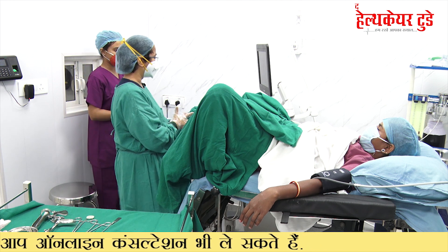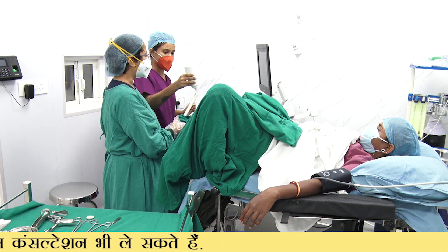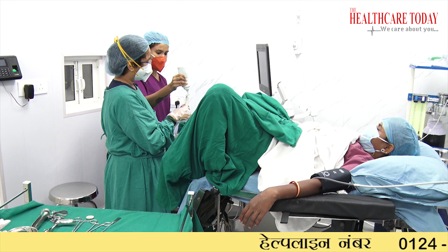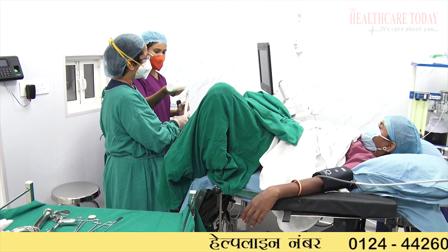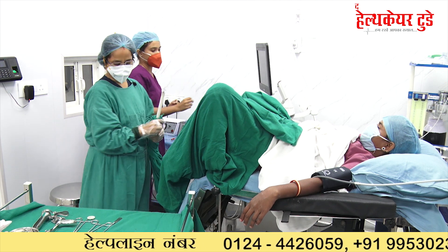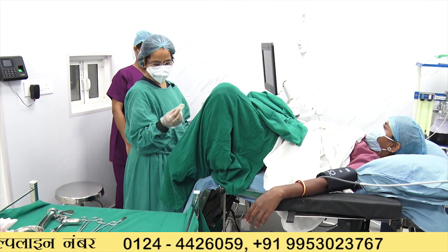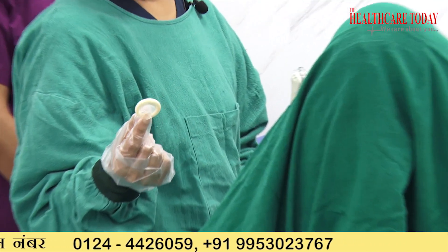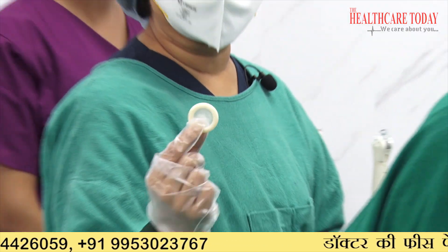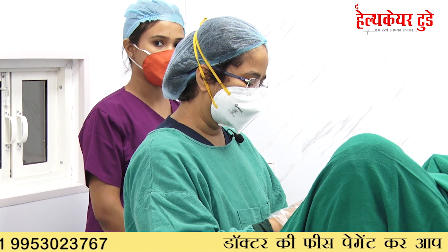Now the jelly has to be applied on the probe. You have to ensure you are not touching the jelly with the same hands. It is very essential that you apply the jelly on the inside of the probe so there is no contact or touch. The probe cover used is not the usual condom — it should not have any jelly because these are all gametotoxic, so you cannot use it.